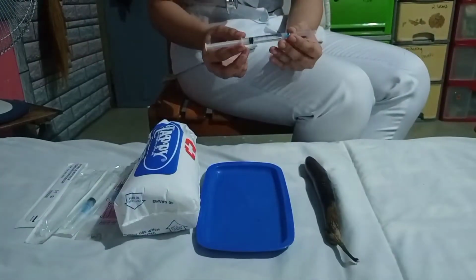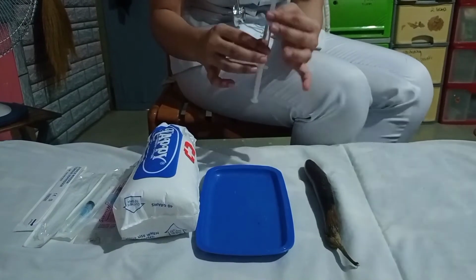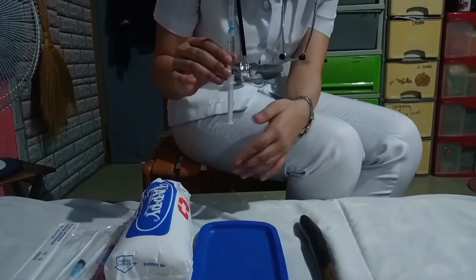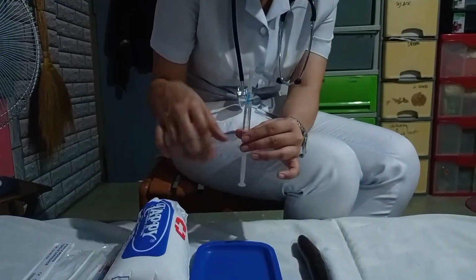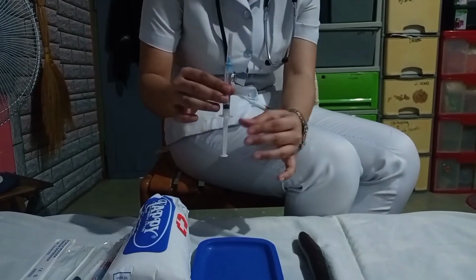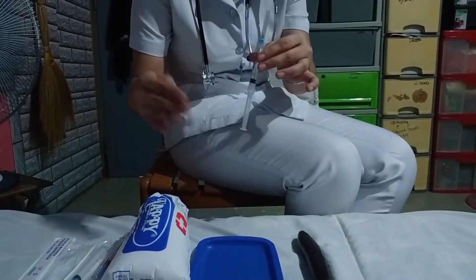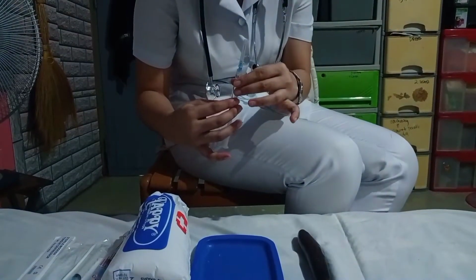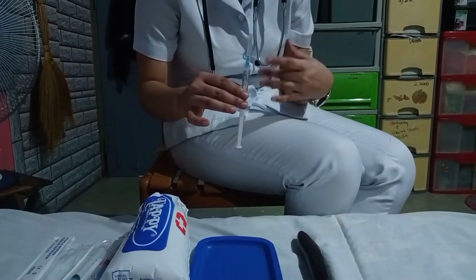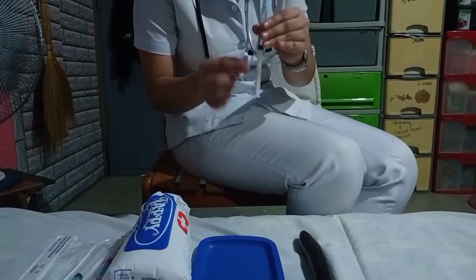Insert the needle into the center of the rubber cap and inject the air, keeping the bevel of the needle above the surface. Position the injection like this. The air will allow the medication to be drawn out easily because fluids move from an area of greater pressure to an area of lower pressure. Now I already have the water as the example medication, and I already inserted the needle so the medication could be drawn into the syringe.